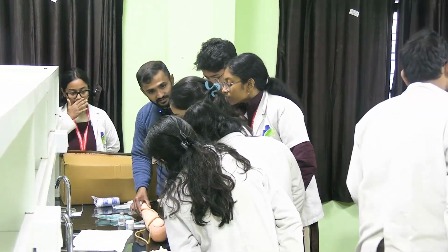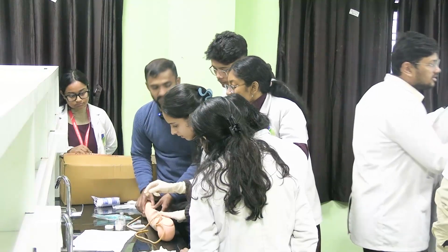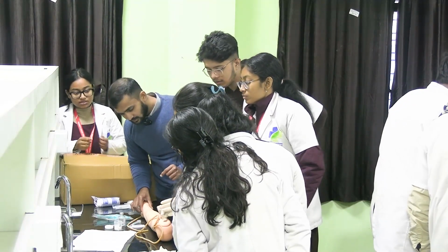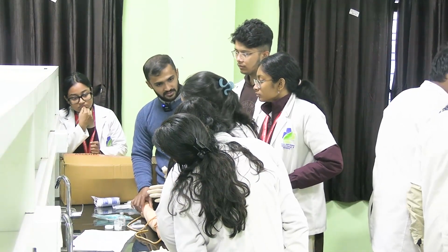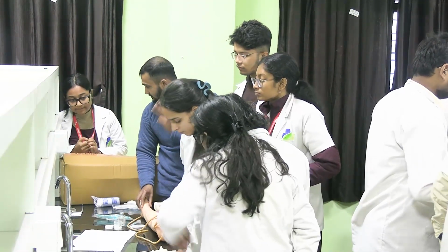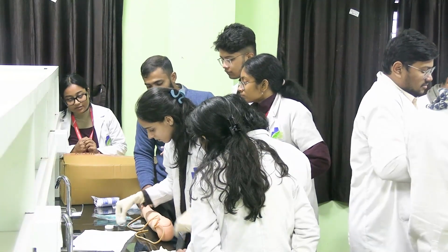Now you have to disinfect the area. How will you disinfect? Alcohol swab. What is the procedure of disinfecting the area? Circular fashion, either clockwise or anti-clockwise. You have to go from inwards to outwards. This is the fashion. You have to do this 3 times with 3 separate sterile swabs. Keep the used one there. Now you have disinfected the area.